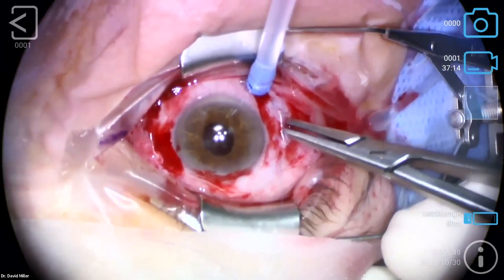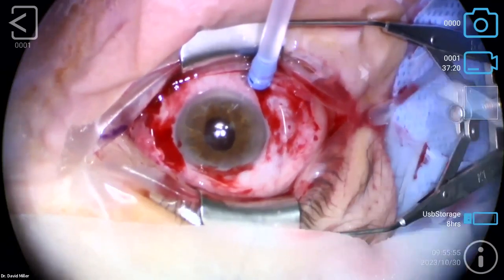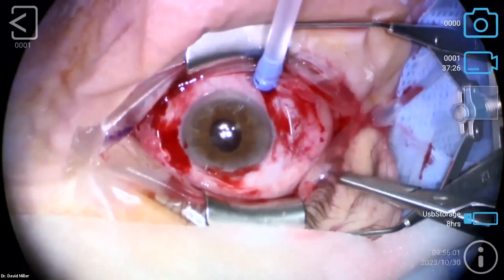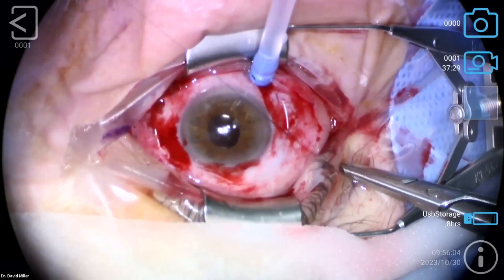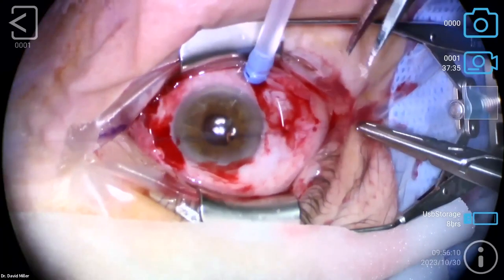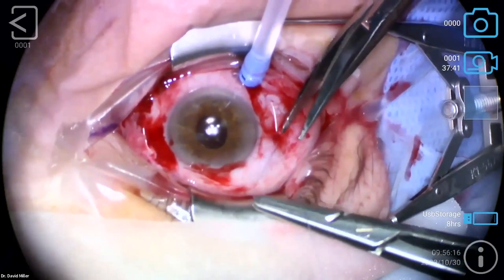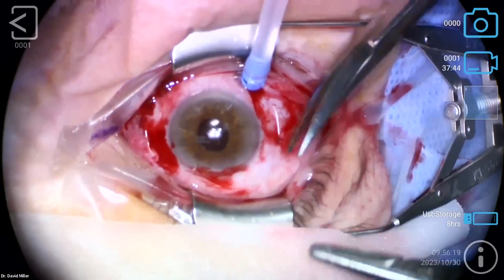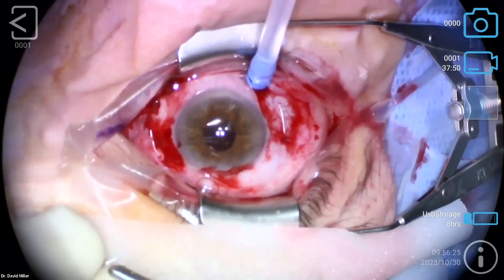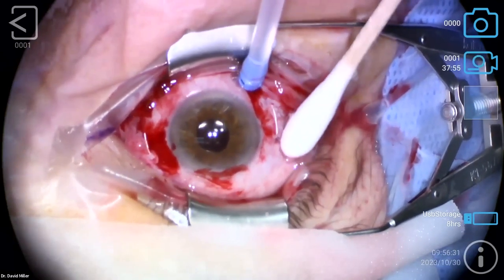And we'll get that little knot out of there. And we just tie this down. Typically, the other sclerotomies kind of close on their own, where we now didn't have the cannulas. I've tried this with 27 gauge just for this reason, to avoid these sutures, but it still had a leak at the working site. So got a Q-tip there for me. Here, and you can dry that site and show them whether we got a watertight closure or not. I think we do. Yeah, so that looks good.